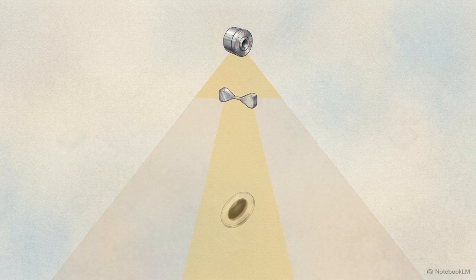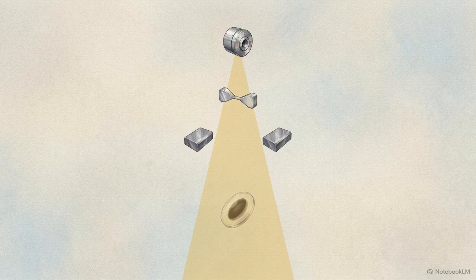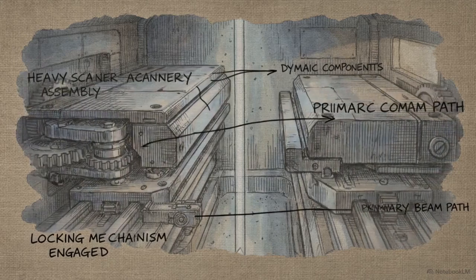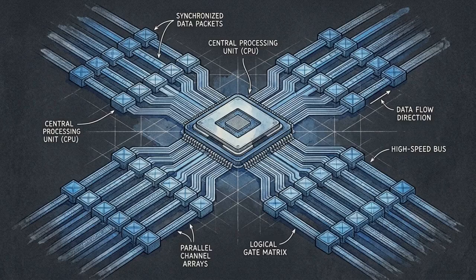Next, a collimator is placed between the filter and the patient. This component physically clips the edges of the beam to restrict scatter radiation from exposing tissue outside the desired slice. Every piece of this beam-shaping hardware serves a single purpose: to remove non-diagnostic photons before they ever hit the patient, strictly minimizing the radiation dose while standardizing the mathematical data the system will receive.